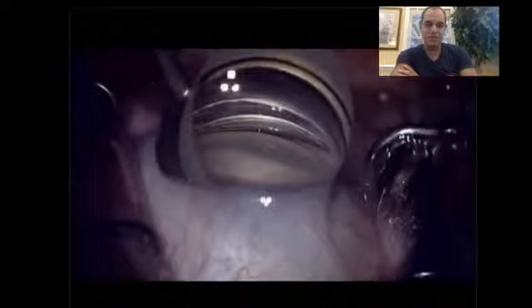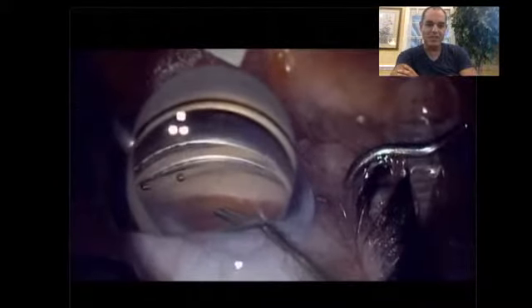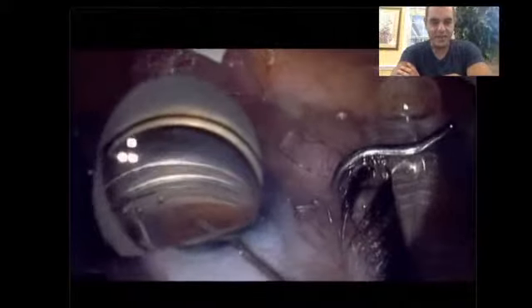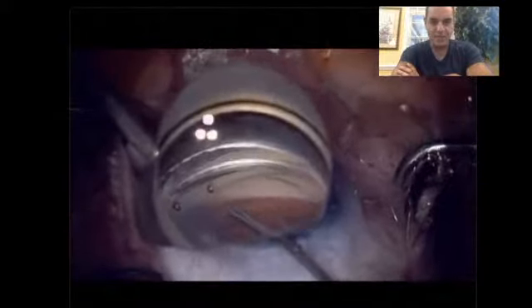So we got a gonio lens in place. We're looking at the nasal angle under direct gonioscopic visualization. Actually, I'm not sure which MIGS device we're using here. It looks like we're doing the iStent Inject. We retract the sleeve and we get ready to place the first of two iStent Injects here. Typically I like to zoom in, so that should be happening fairly soon.